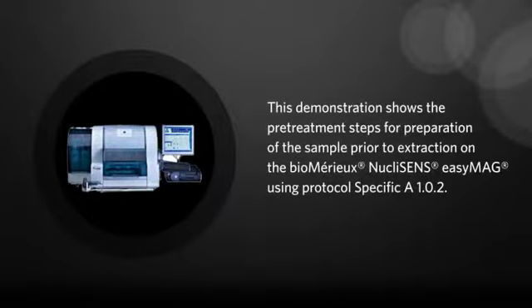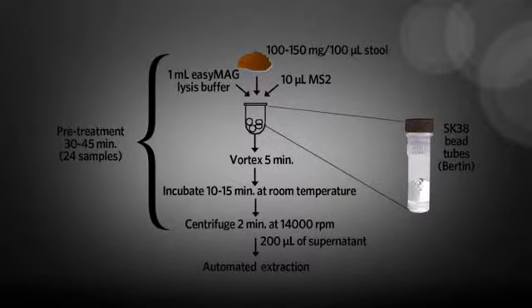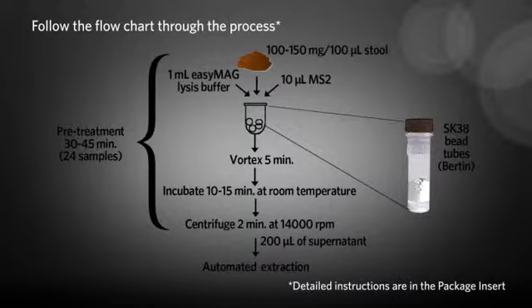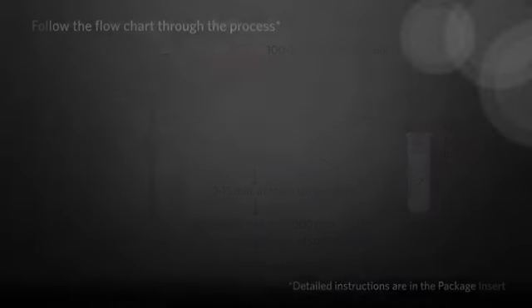This demonstration shows the pretreatment steps for preparation of the sample prior to extraction on the BioMérieux NucliSENS easyMAG using protocol specific A1.0.2. The flowchart here illustrates the procedure. We will follow it throughout the video. Please note that detailed instructions are located in the package insert.